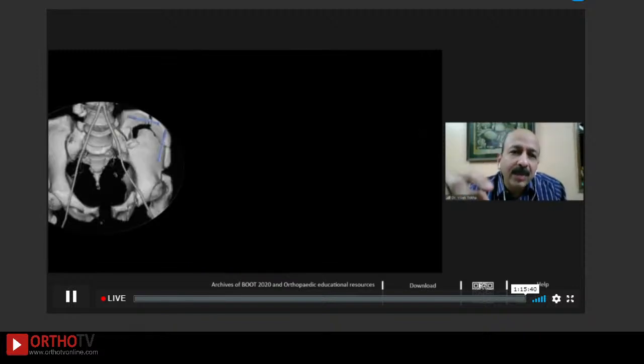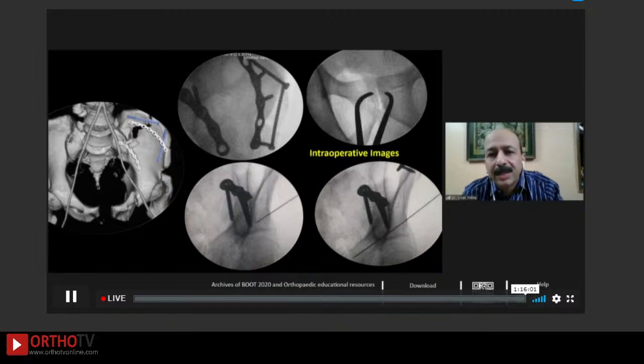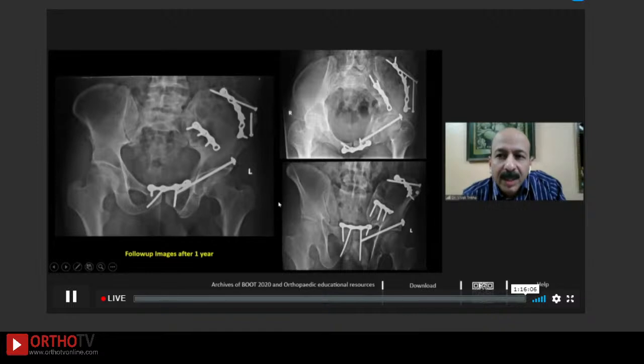We had a plan that after reduction, we'll put in the screws out there with an additional plate, which is going to fix the posterior fragment along with the anterior fragment. And then we'll put in a normal SI joint plate, which will be fixing both the fragments with the sacrum, which is intact out here, and the ilium to it. And in the front, we will be doing the same reduction with the symphyseal fixation, as well as here we put in a screw out there. So this is the fixation which we got at that time.